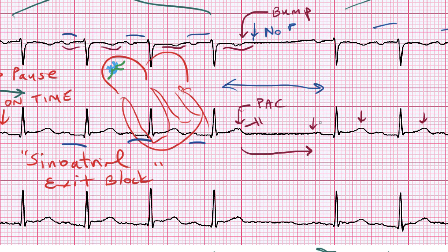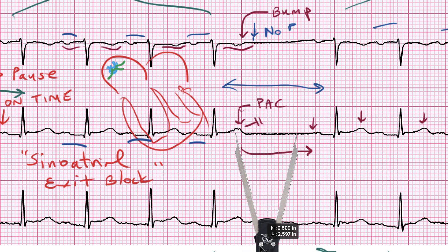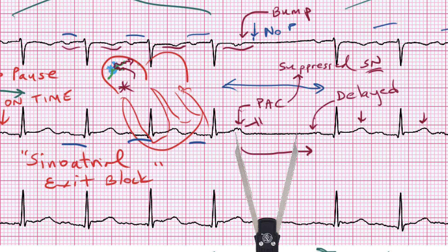If we take our calipers set for the P-to-P interval and measure from the PAC, we see that this sinus beat was delayed by about 200 milliseconds or so. It got delayed because it takes about 100 milliseconds for the PAC to get into the sinus node, reset it, and for the next impulse to come back out again. So indirectly, we're actually measuring the sinoatrial conduction time, which is discussed in the expert-level course when dealing with electrophysiologic testing and determining sinus node function. So this delay in the next sinus beat is all to be expected.